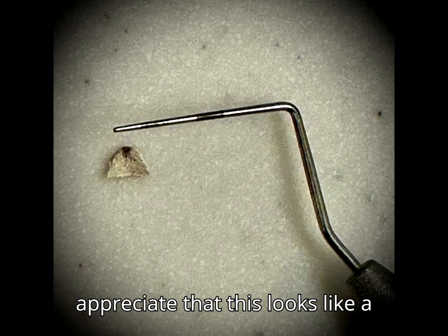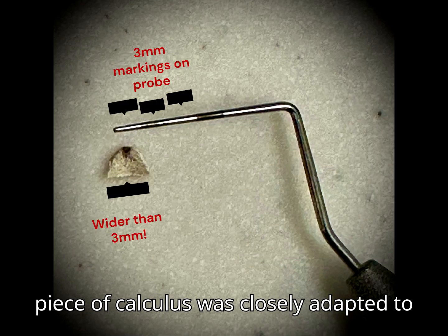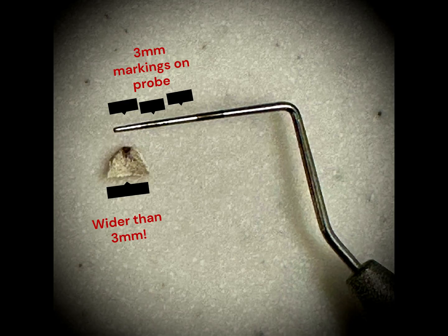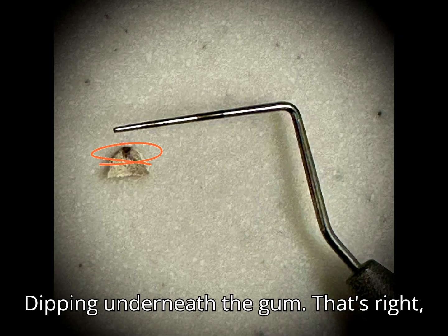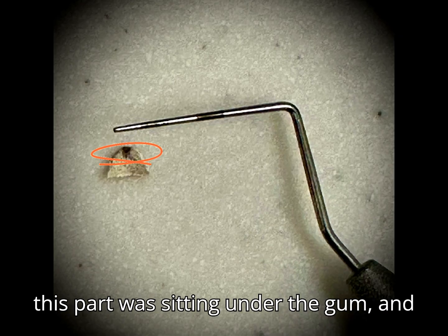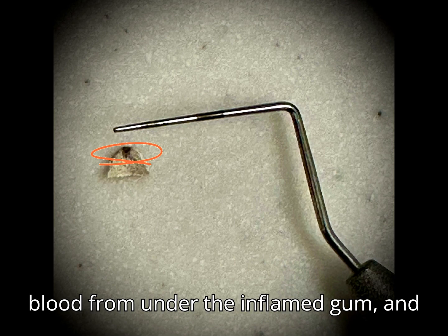You can appreciate that this looks like a fingernail almost — that's because this piece of calculus was closely adapted to the tooth's root surface. The dark part you see here was actually dipping underneath the gum. That's right, this part was sitting under the gum, and that's why it has absorbed some of the blood from under the inflamed gum.